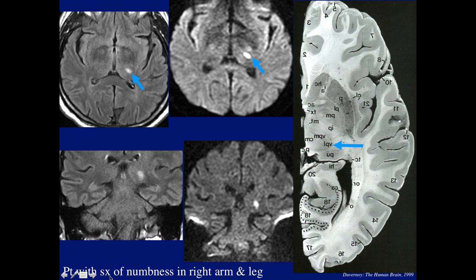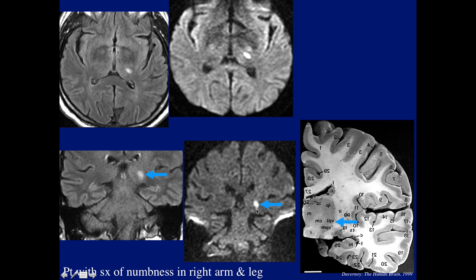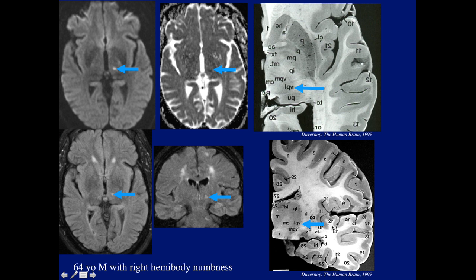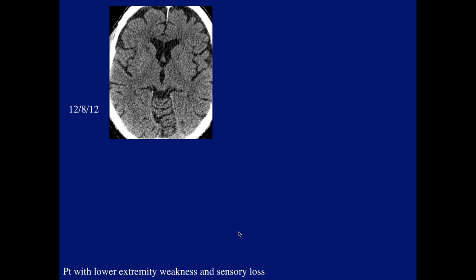Another patient with numbness in the right arm and leg: lesion on the left side of the thalamus in the region of the ventral posterolateral nucleus — on coronal image it fits perfectly. Another patient with right hemibody numbness: a small stroke with multiple other lesions, but this one in the location of the VPL — ventral posterolateral nucleus of the thalamus — explains the symptomatology.